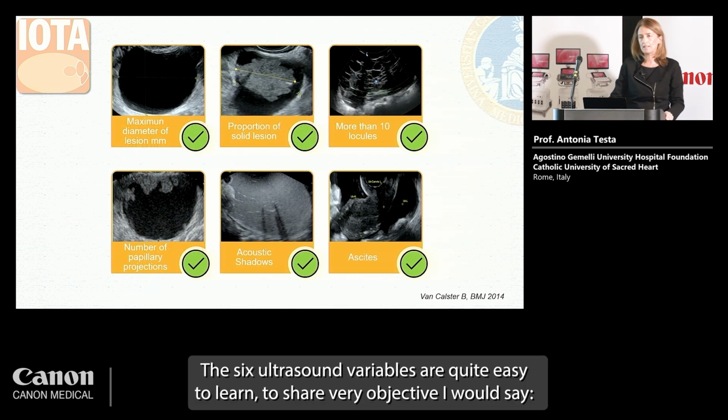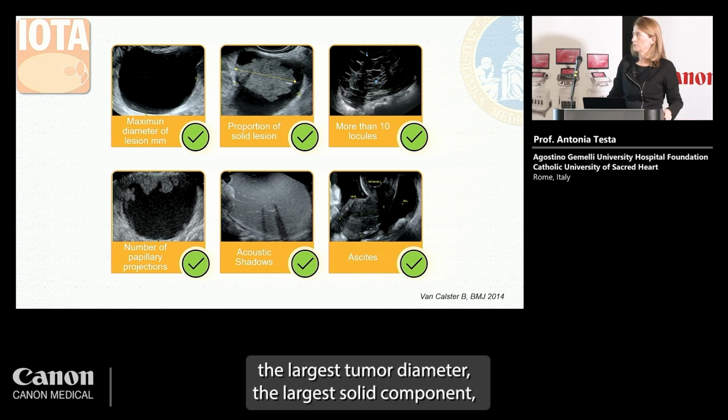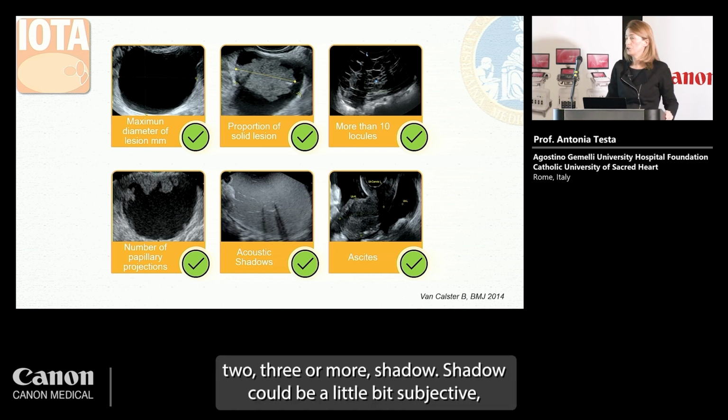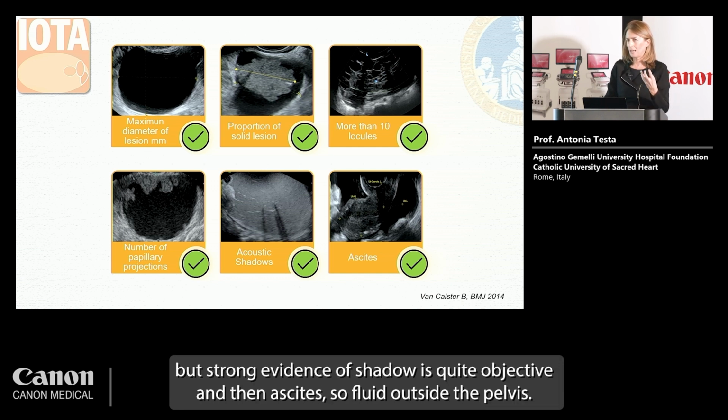The 6 ultrasound variables are quite easy to learn, to share, very objective, I would say. The largest tumor diameter, the largest solid component, the number of locules, less or more than 10, number of papillary projections, 1, 2, 3 or more, shadow. Shadow could be a little bit subjective, but strong evidence of shadow is quite objective. And then ascites, so fluid outside the pelvis.